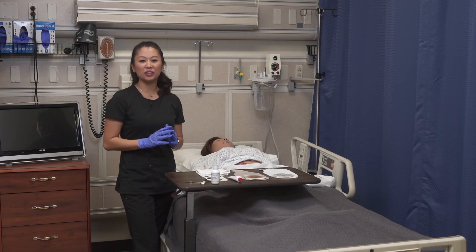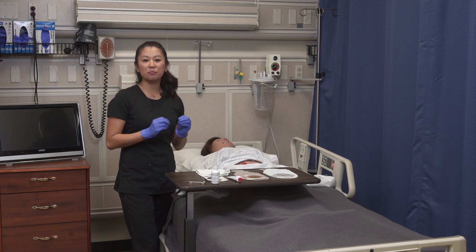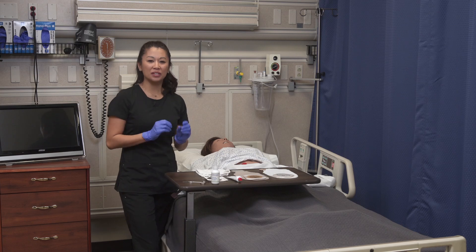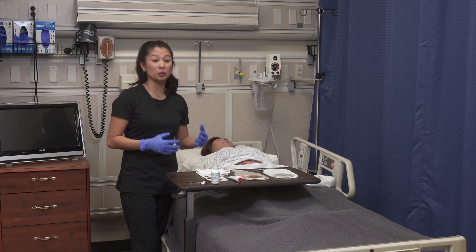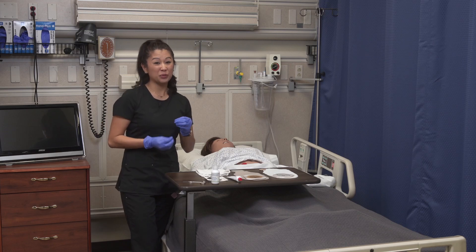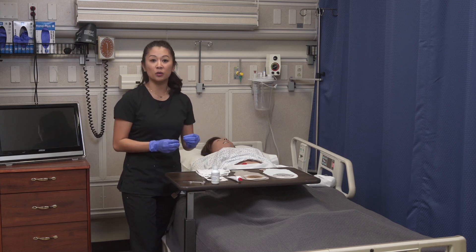Let's take a look at how we change an ostomy pouch. I've already removed the old soiled pouch, done my hand hygiene, and put on new gloves. Now let's take a moment to look at the equipment. Anytime you're changing an ostomy, there's going to be potential stool coming from that, so make sure your patient has extra towels or absorbent pads underneath them. Sometimes you may have to move quickly, but I really want to get you familiar with the equipment and the process.